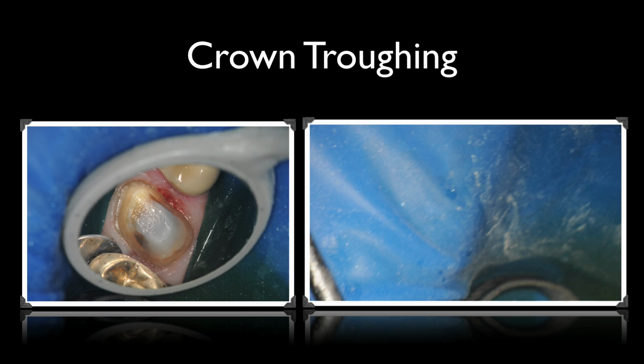You'll find that with the diode, you're not only creating a trough, but you're conditioning the tissue as well. Now, some people feel that they're far faster with cord, and you can be far faster with laser too. If you want to use high wattage, you can use that. But again, for me, there's always a worry about should recession occur with the laser.